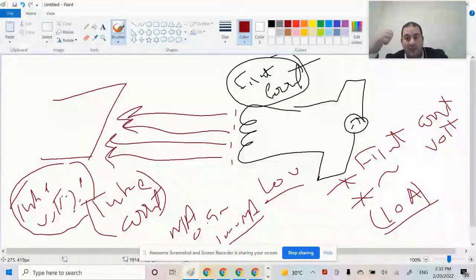When the number of electrons increases, they interact with a greater number of atoms at the anode, further increasing the number of X-rays. Thus, filament voltage affects the number of electrons, and tube voltage affects the energy of electrons, resulting in more imaging.